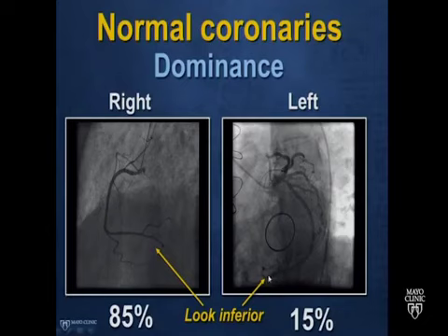The first question you should ask when you're looking at the inferior wall is, what is the dominance? Because the dominance will help tell you whether to code that inferior wall and the pathology there in the right coronary artery or in the circumflex territory. Most of the time, we're right dominant, and that's usually defined as the PDA supplying the inferior wall. Other definitions also include the AV node branch, but for the board purposes, I would just focus on what vessel supplies the PDA, whether it's the right or whether it's the left.